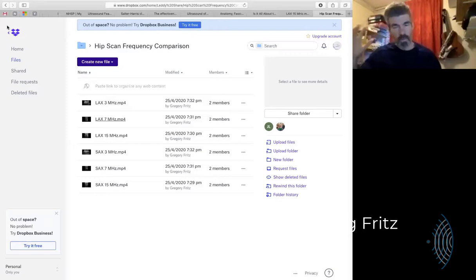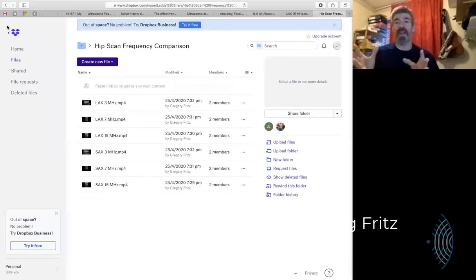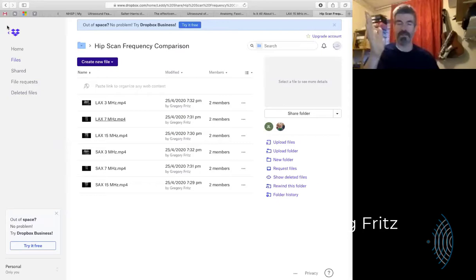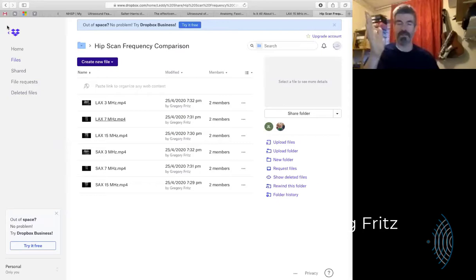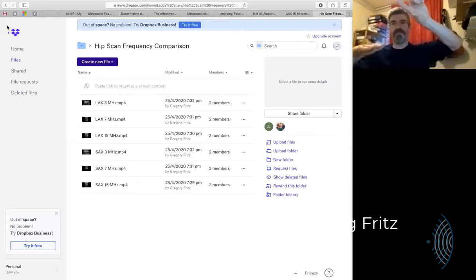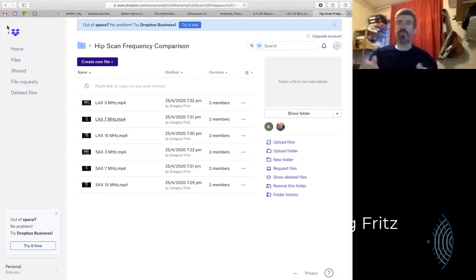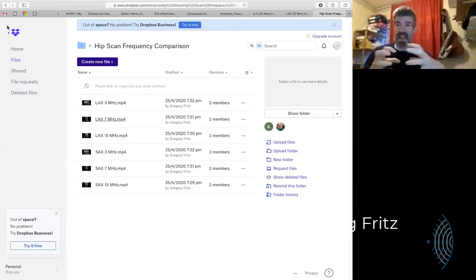That would require that I heel-pressure and keep the angle wagged on the center of the femur, keeping the periosteum as bright as I can. That's certainly going to be one of the strategies — you wouldn't just use one strategy. I start off by looking for that line of the shaft — getting the sense of it — and in the anterior view, see the curved shape of the head, the curved shape of the base of the head, and get a sense of hopefully a nice ball there. And then that relationship with the acetabulum — when you've got that orientation, you should then see the acetabulum like in an anatomy book, as a nice cup.